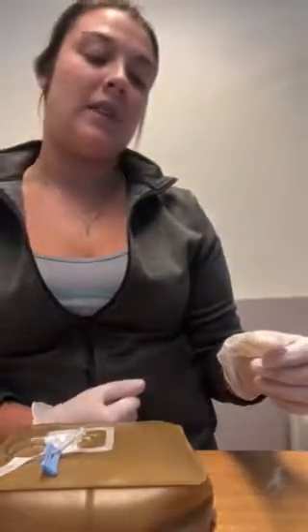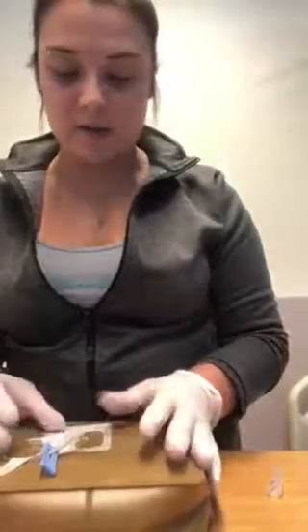Okay, so I've already made my med label a while back. I've dated the label, I have signed, and I have the concentration that was on the actual ampule. So it was morphine, 10 milligrams per milliliter, so I know that's exactly what I have in here. I'm going to fasten my label, making sure I don't cover the window of my site.